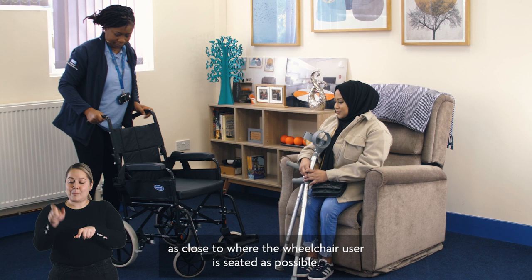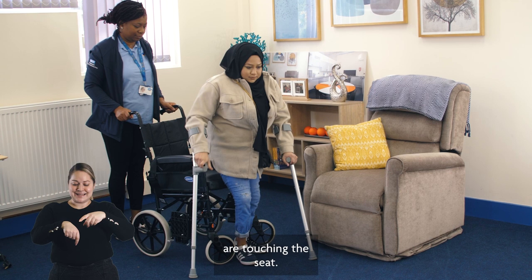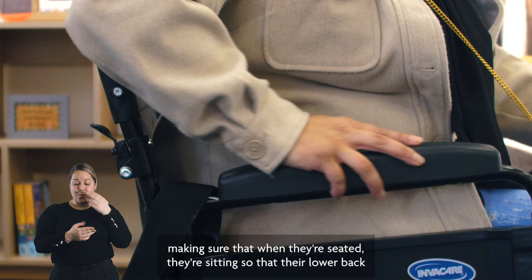Move the wheelchair as close to where the wheelchair user is seated as possible. Lock the brakes and then swing the foot plates out of the way before guiding the wheelchair user to the wheelchair. The wheelchair user should stand so that the backs of their knees are touching the seat.